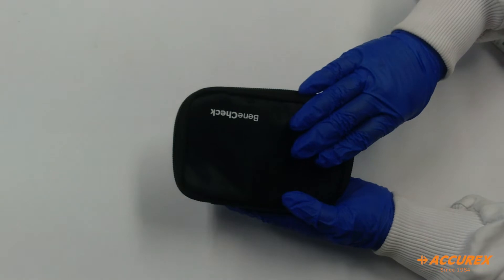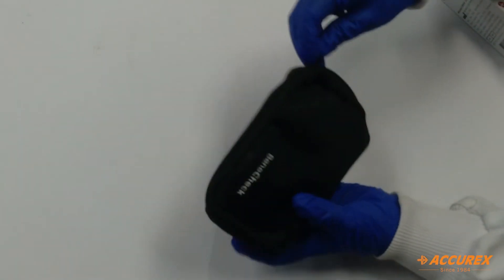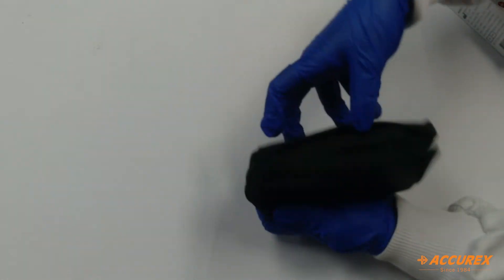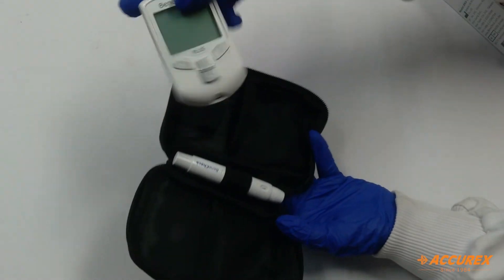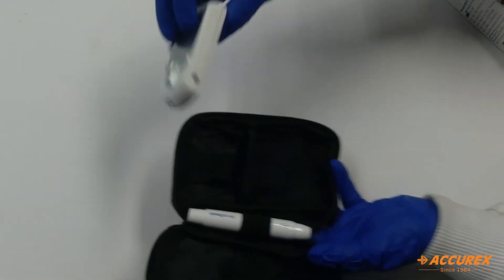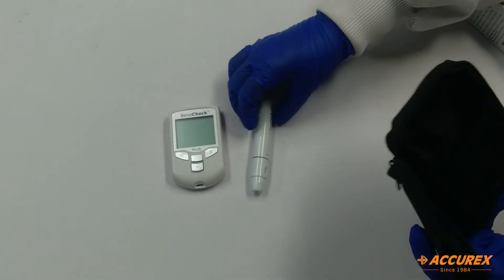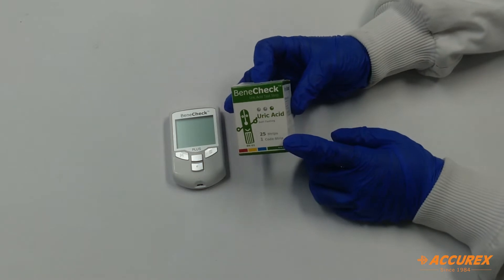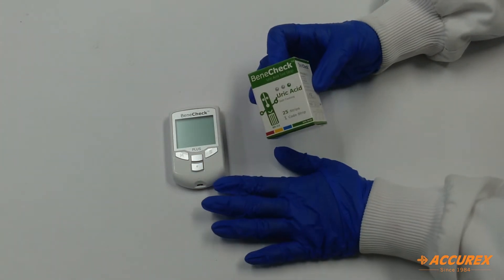So we will see now what is inside this black pouch. In this we have the BeneCheck meter and one lancing device. This is the BeneCheck strips. With the help of this strip you will test in this BeneCheck meter.